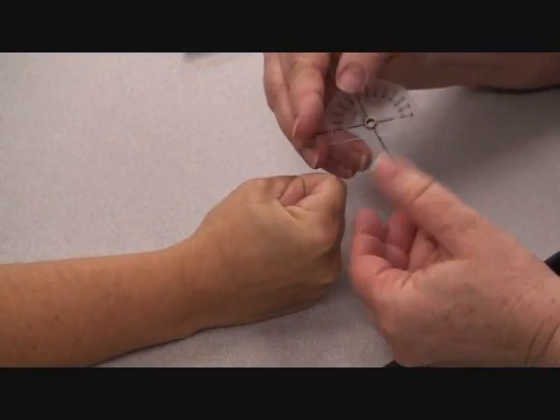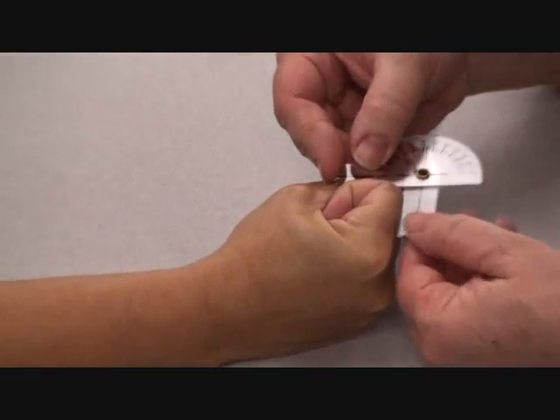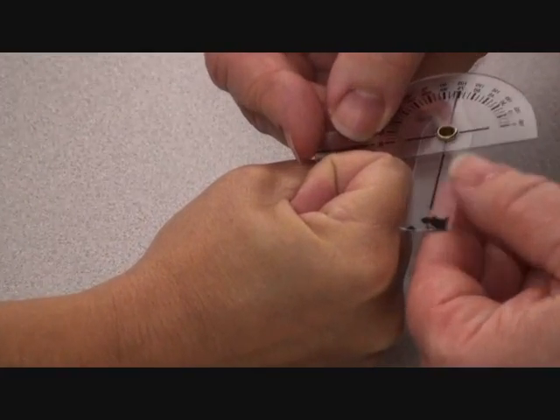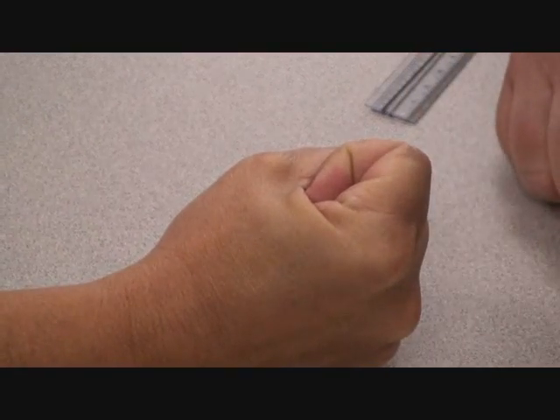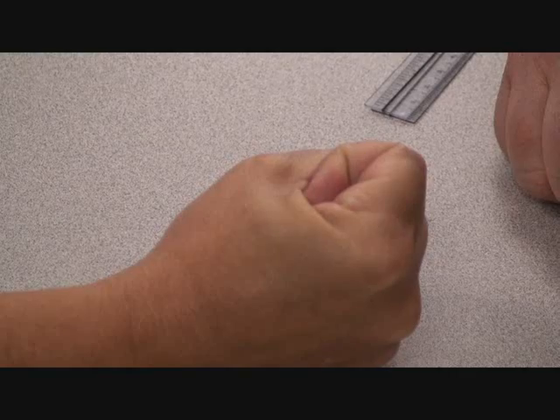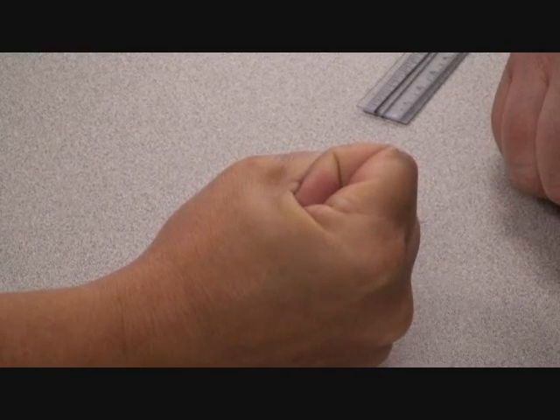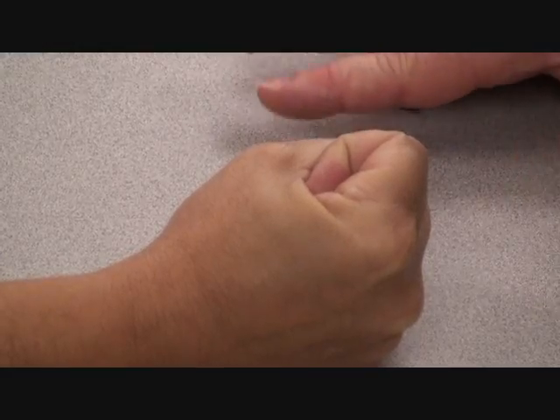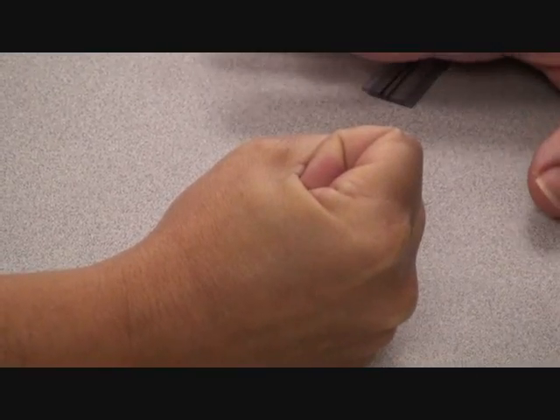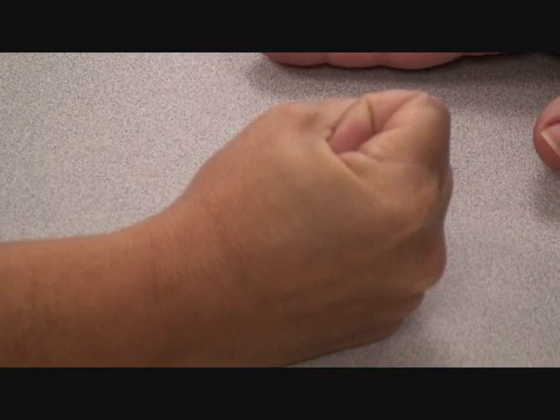Okay. So we can go over the top with PIPs. So going over the top here, is this going to be more or less than 90? More. PIPs, it's more. Most people who have full range of motion is going to be more than 90.